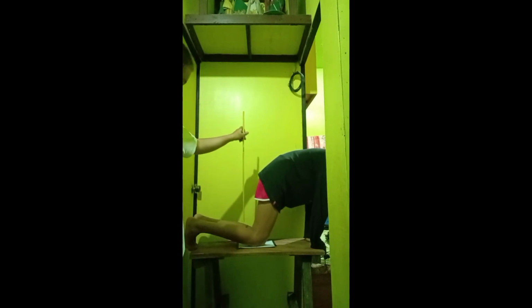The central ray is perpendicularly directed, the same as in the PA axial Holmblad natin kanina. Ito siya papasok. This projection will demonstrate to us the femoral condyles, eminences, and the intercondylar fossa.